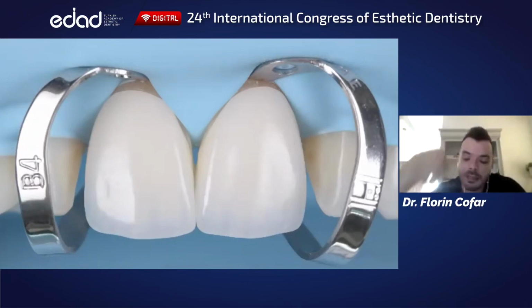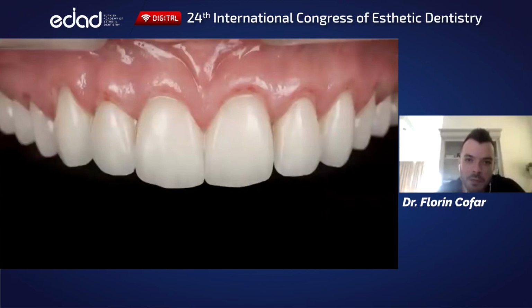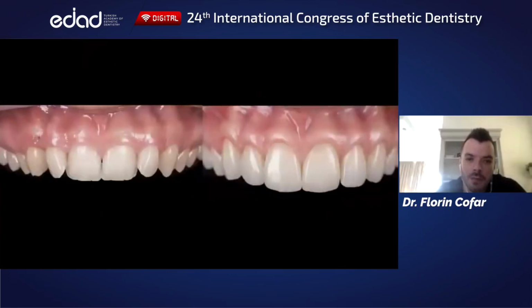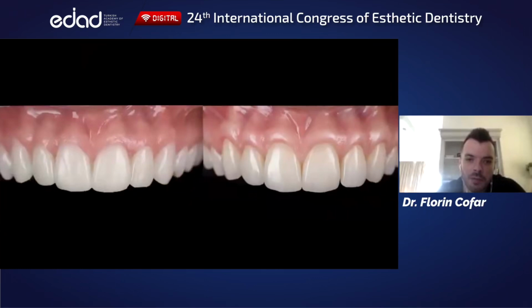you can see this example here is simply stain and glaze. This is immediately after the bonding, after the surgery, and this is after it heals. What I want you to look at is not specifically this before and after. Rather, I want you to compare the design and the final in terms of copying ability.